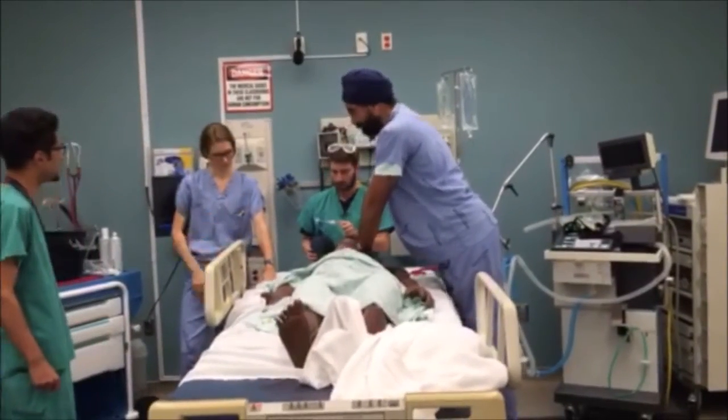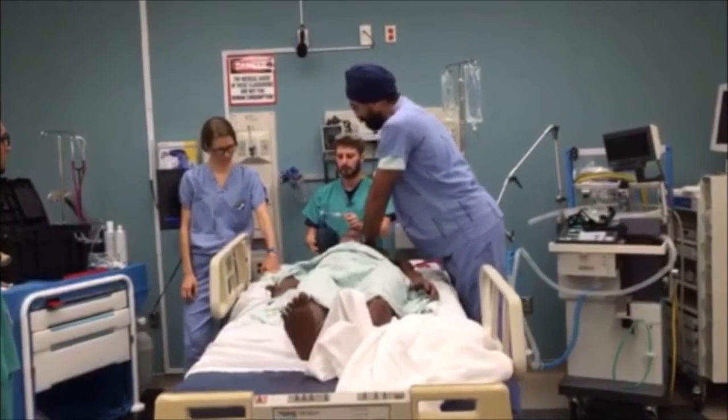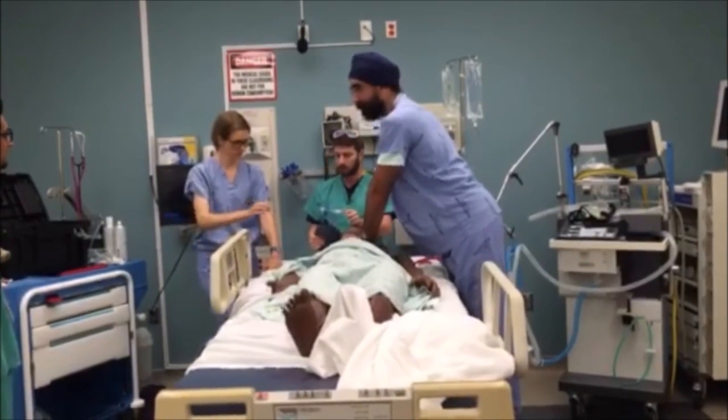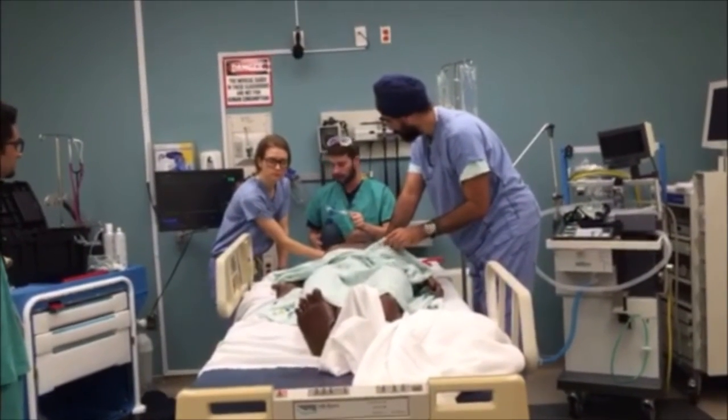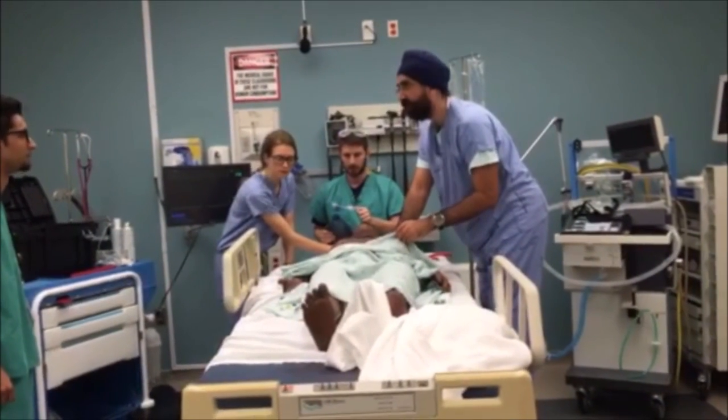Okay, great. So is it time for a pulse check right now? We're at 2 minutes. We can do a pulse and rhythm check. All right, yeah. I think we have an end-tidal of 40. I feel a pulse. I have a femoral pulse. That's awesome.